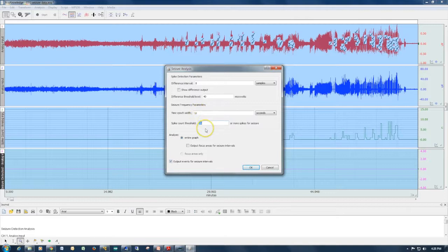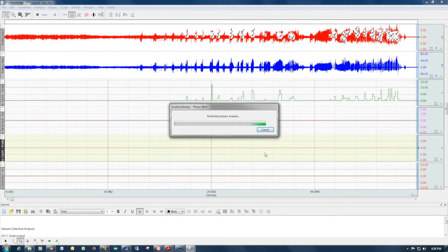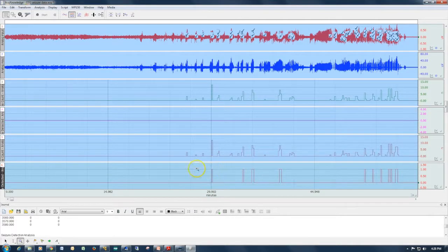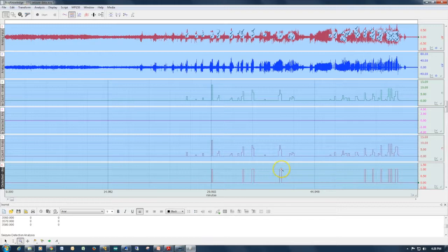Going back to the analysis dialog, we had set it up so that 20 spikes within a 10-second window were required for the software to classify an epoch as containing a seizure. If I reduce this down to five and run the analysis again, the spike count channel hasn't changed because we used the exact same detection threshold. But the seizure classification channel is now showing a one at certain points, indicating a seizure was evident within that time epoch or multiple time epochs.